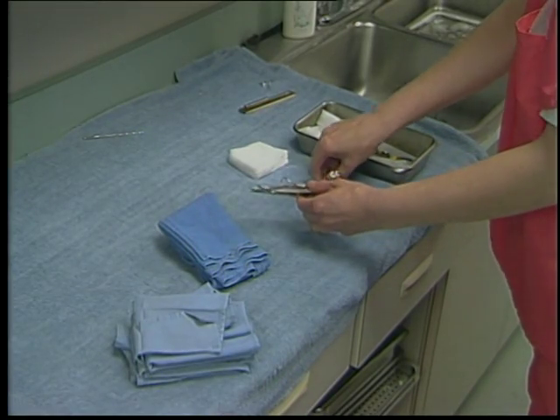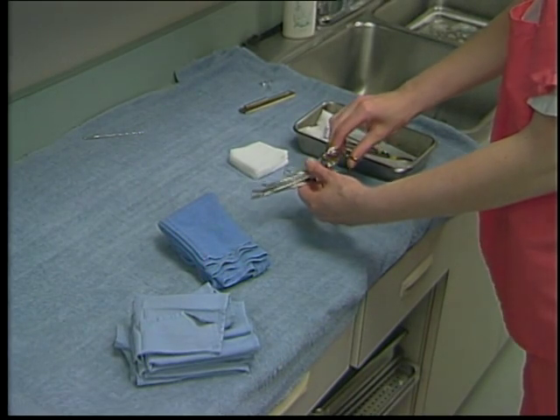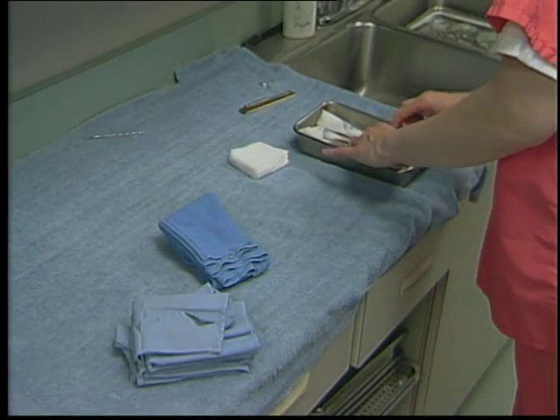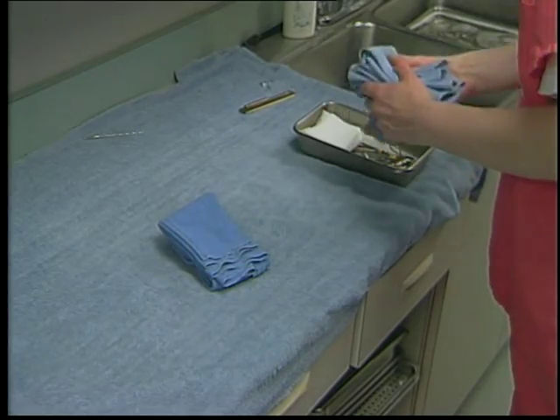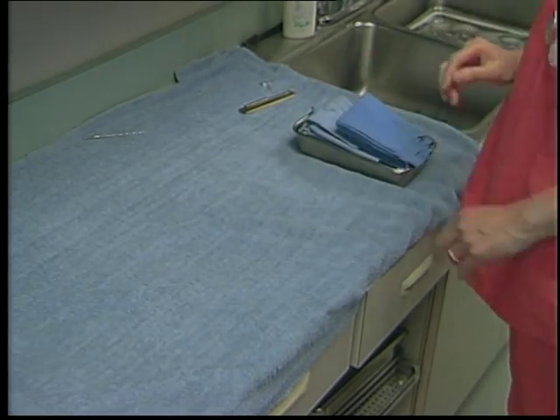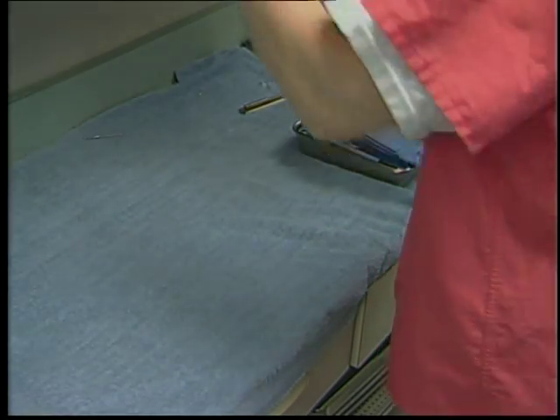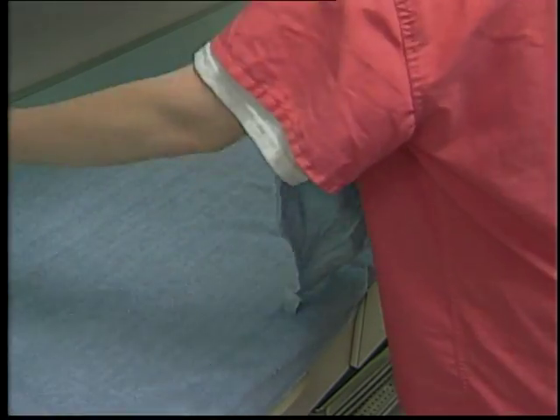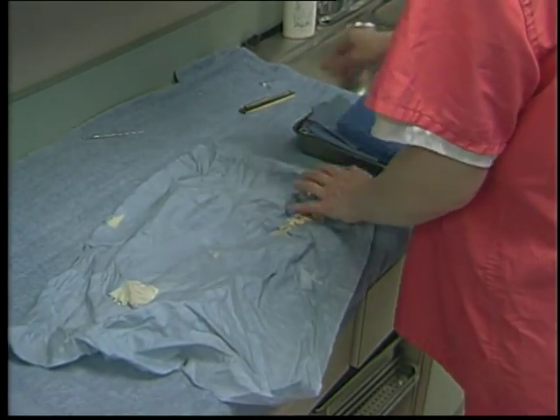The packing of the instruments will vary greatly based on the preference of the surgeon. A few principles will be helpful when arranging the surgery packs. First, the instruments are loosely packed in such a way that no sharp pointed instrument will penetrate a wrap, especially paper wraps. Second, be sure that all accessory items are included. For example, drapes, gauze sponges, a sterile indicator, suture needles, scalpel blades, and hand towels are sometimes included in the surgical pack. And finally, be sure the surgery pack is either double wrapped or wrapped in such a way that it can be opened without breaking its sterility.